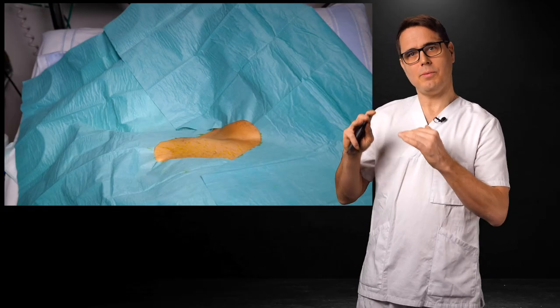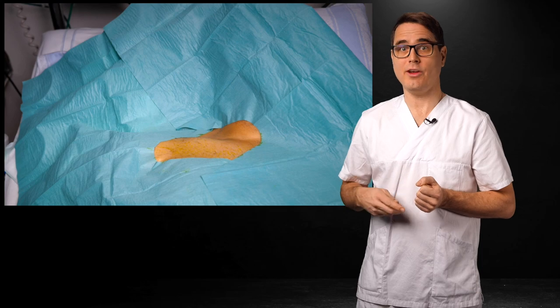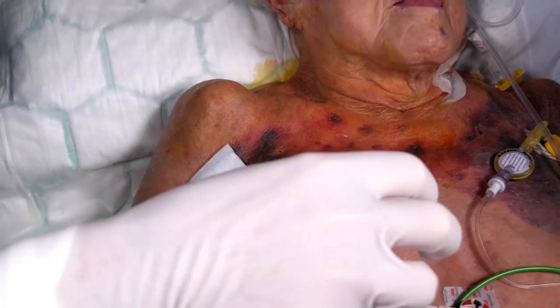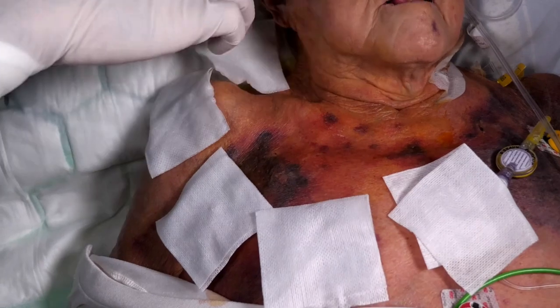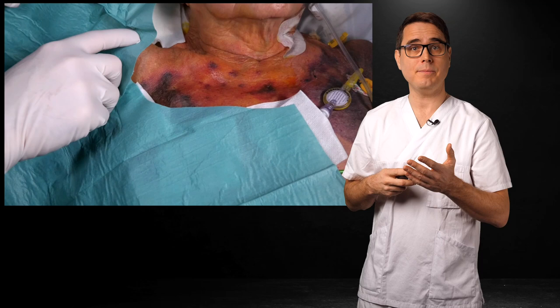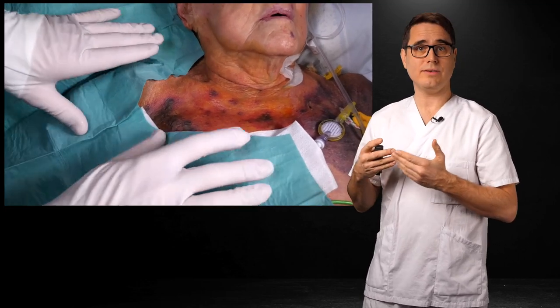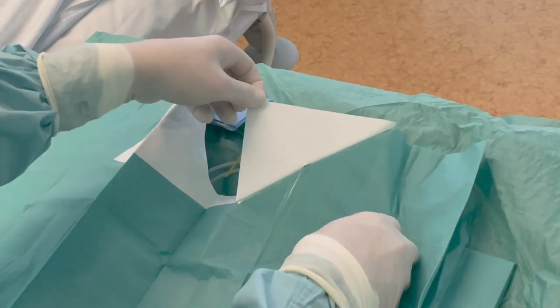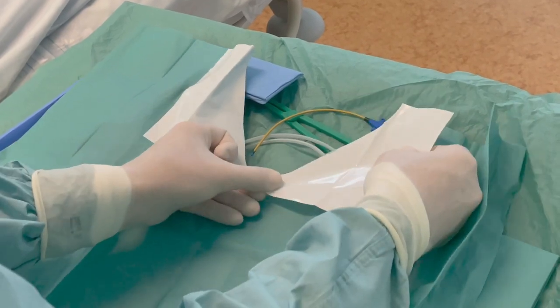Note how I fold the top of the drape in order to not completely cover the patient's face — it can get pretty claustrophobic inside there otherwise. This patient has extremely sensitive skin due to chronic steroid medication. You can easily rip the skin apart if you're not careful when you remove the adhesive drapes. We suggest using gauze pads for protection, and similarly gauze can be used to cover wound dressings or other catheters that will be covered by the adhesive drapes.